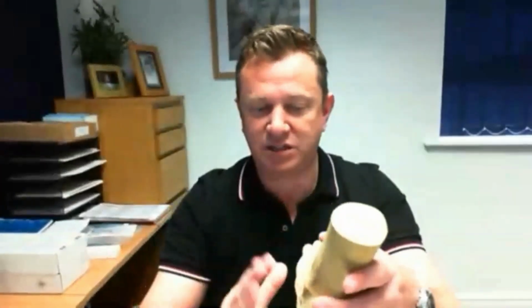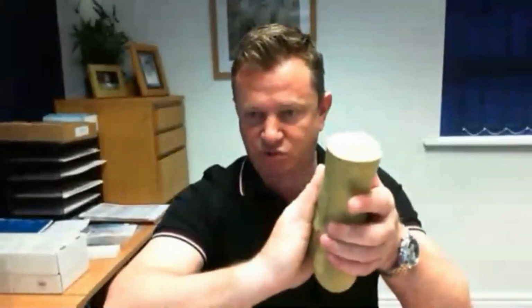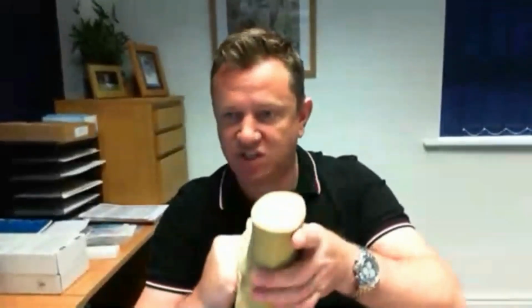Lateral straps in terms of cuboid straps, lateral Y straps inside AFOs, or even T straps in old calipers, they should be used when you have a structural instability, when that foot has no internal mechanism for stabilizing it and your functional forces, your external forces, don't overcome it. I used to say that if you prescribe an AFO with more than 2 straps, you designed it wrong.